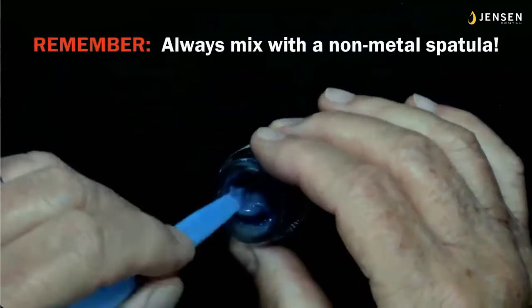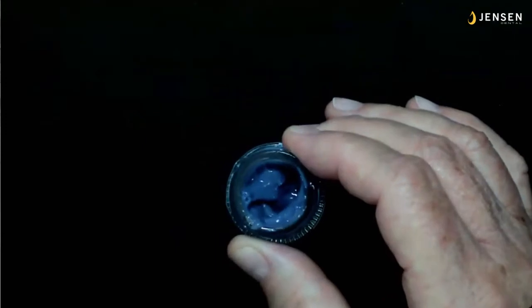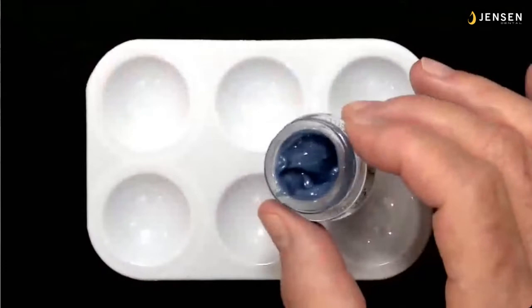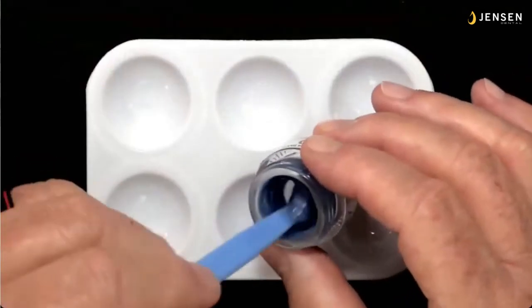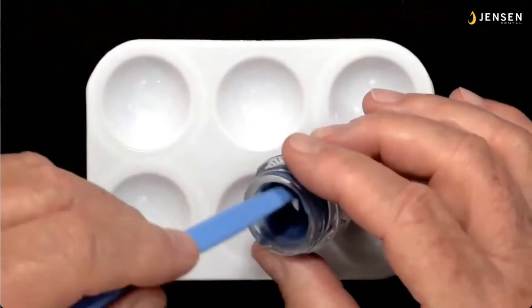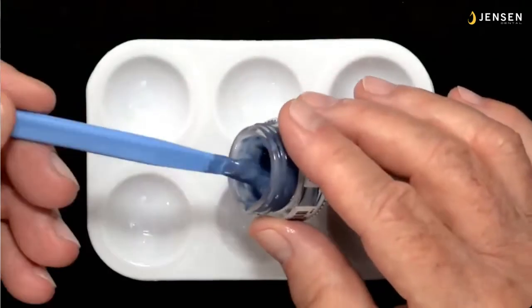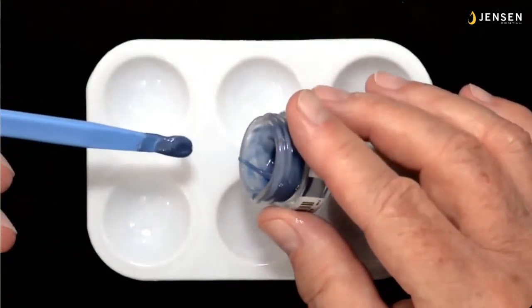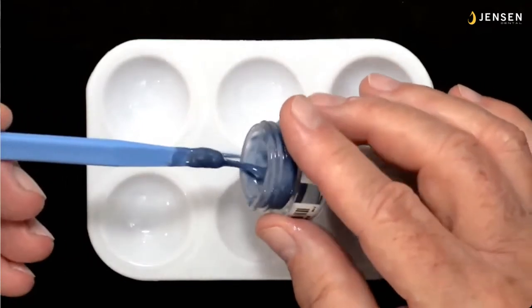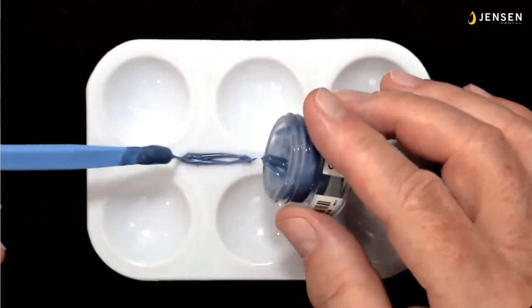When you mix with a non-metal spatula, it generally takes me about 5 seconds to mix out of a jar. I would say anywhere between about 5, 6, 7 seconds is good. A couple times around the outside of the jar, across the bottom 2 or 3 times to disturb anything that's settled down, and stir it out again. Then I can pull the spatula out of the jar and see if it sags and check my viscosity and my consistency. So you see I pull it out and it sags down, and it was hanging there kind of like honey. And you can see how far I can string that.